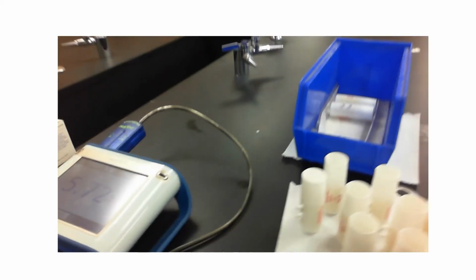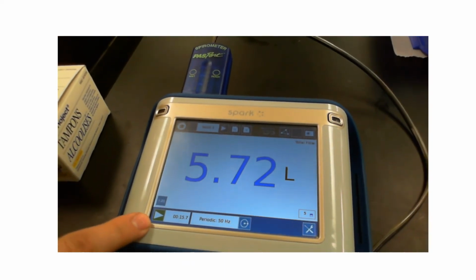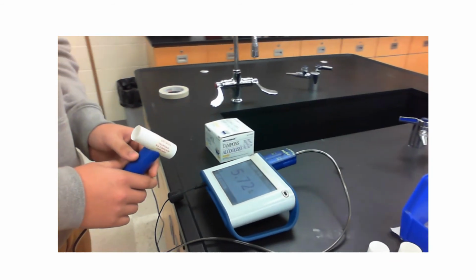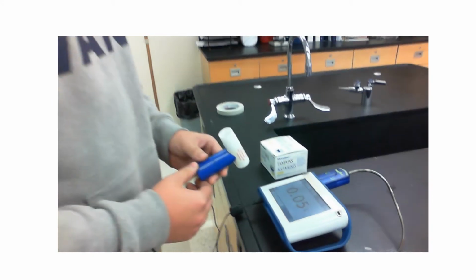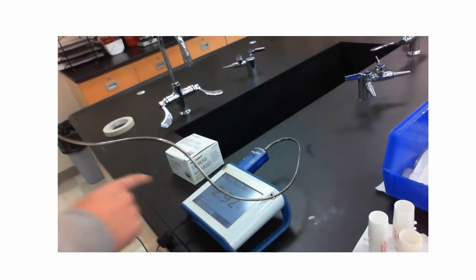On the screen, what you're going to see is a little green triangle on the left-hand bottom corner, and that's the one we use to turn it on and off. So the first reading is going to be your tidal volume. That's a normal breath in, normal breath out. So you press that little green triangle in the bottom left on the little blue adapter, wait till the light turns green in the top or right side, and then normal breath in, put the mouthpiece in your mouth, and normal breath out. When you're done the breath, you stop it, and you record your volume in the spot that says your tidal capacity.